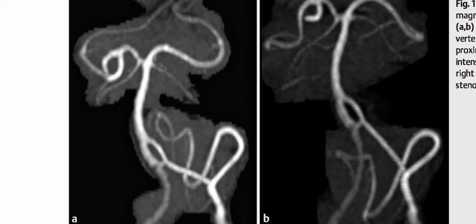So the key finding here is of separate arterial lumens that are converging proximally and distally. So this is a case of arterial fenestration. This is a diagnosed case of arterial fenestration.